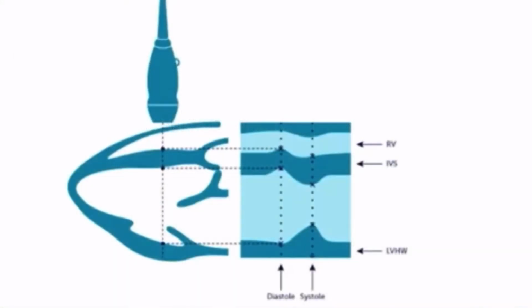help you understand how M-mode works. We have an ultrasound ray which is emitted, and if it hits a boundary of the heart, it gives a reflection. Another reflection here, another reflection here. But since the heart is moving, the boundary also moves, and therefore we have the typical M-mode tracing. Don't forget, this is the time axis, and this is the depth of the ultrasound.